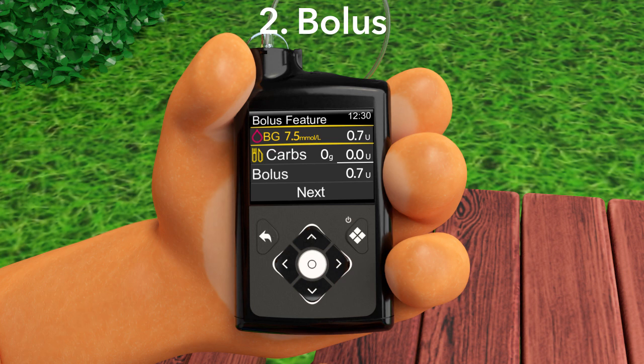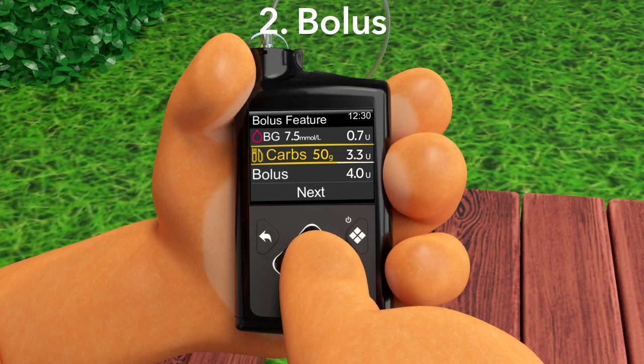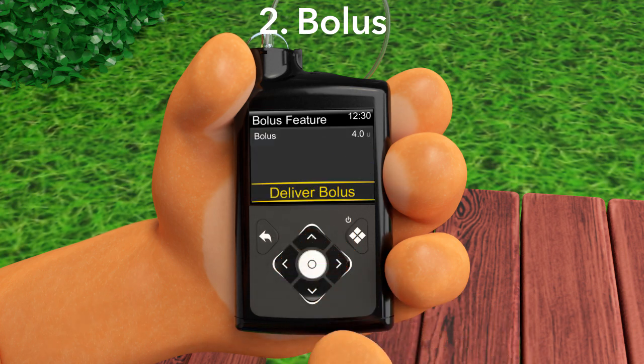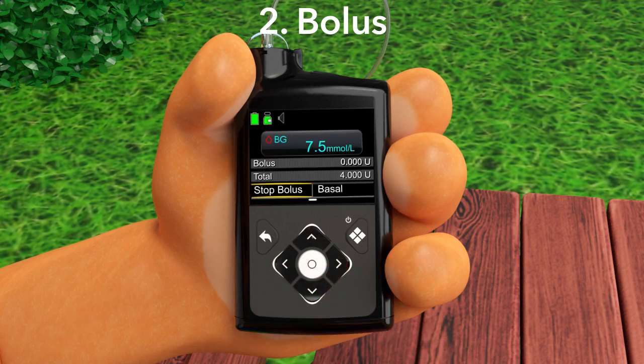Next, type in the amount of carbs you are going to eat into the bolus feature. We calculated that Lenny's lunch is 50 grams. We type in 50. The pump will calculate the bolus you need for your lunch. When you are ready, press Deliver Bolus. And there you go! Your pump is now delivering your bolus for your food to your body through the tubing.